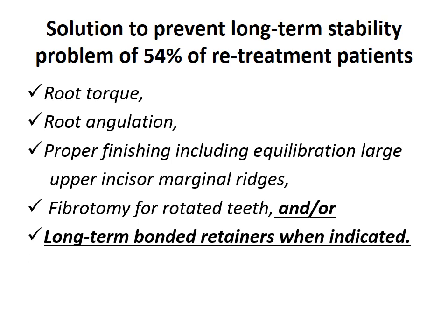And as I mentioned, Dr. Van Arsdale and Zacherson have been supporting this idea for over 2 decades. And it's an important concept that many of us have adopted to maintain our patients in a stable situation after treatment. However, in this study, we discovered that there can be a problem or a side effect with long-term bonded retainers.